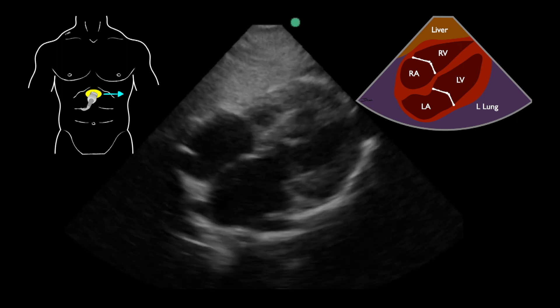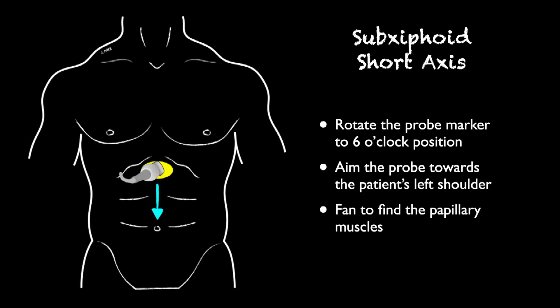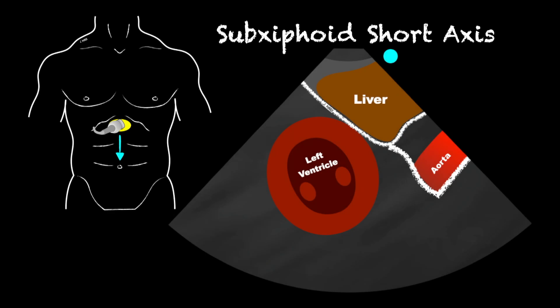From this view, we want to keep the heart in view to move to our subxiphoid short axis view. We're going to rotate our probe marker to the six o'clock position, or towards the umbilicus. When we do this rotation, make sure you continue to aim the probe towards the patient's left shoulder, then fan the probe until you can see the papillary muscles. The diaphragm is visible between the liver and the heart, and sometimes you'll see the aorta depending on the plane. This is a great view — think of a central dot in the middle of the left ventricle and appreciate how concentric the contractility is and how well it's functioning.